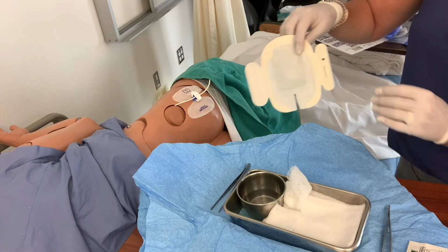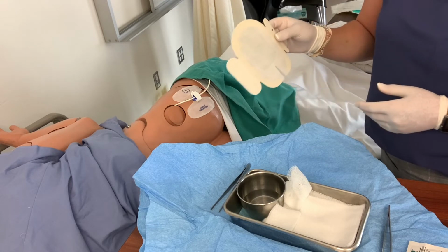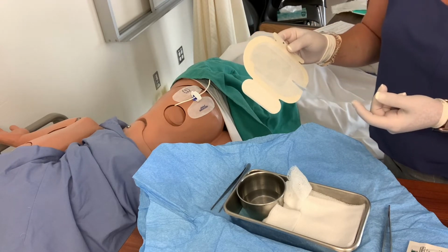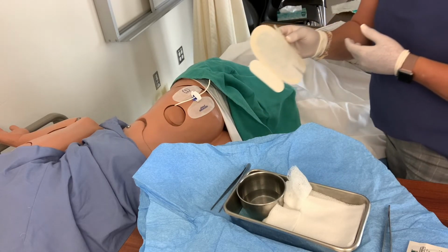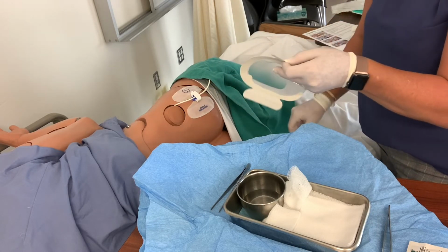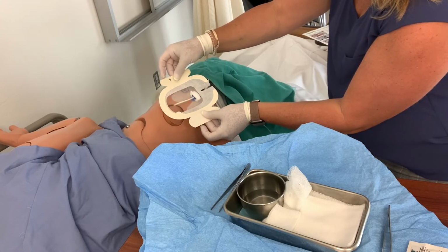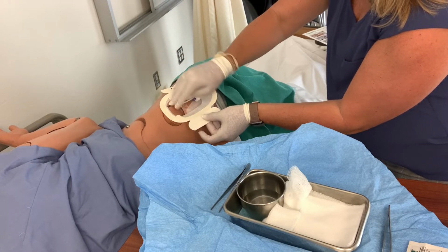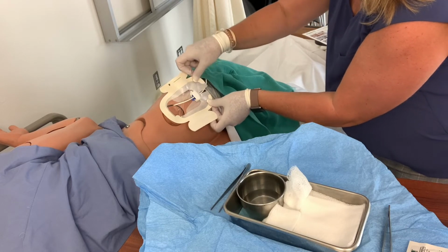The transparent dressing that I'm going to use is not actually the correct one. We don't have the correct ones, but they use an Opsite 3000. And I know in Unit 2, you typically have to call for those. So that might not be an item that's available on your unit, so you may need to call ahead in advance. So now I'm just going to take the transparent, clear, occlusive dressing, and I'm going to cover the insertion site. Again, this is not the right dressing, but I'm going to cover the insertion site with about 1 inch around the actual insertion site, and I need to cover the StatLock as well, okay?